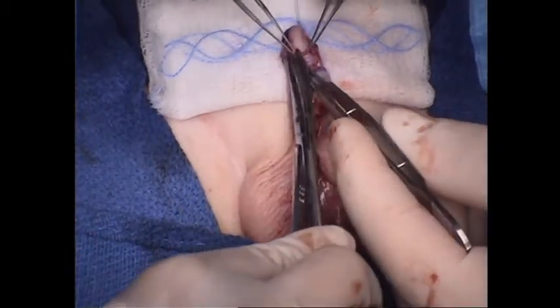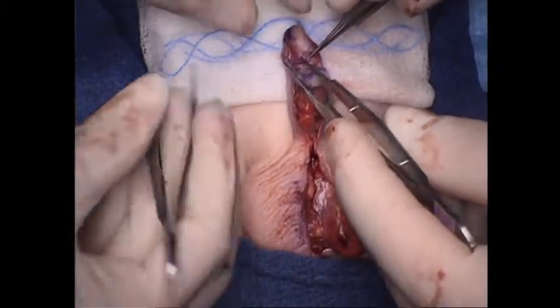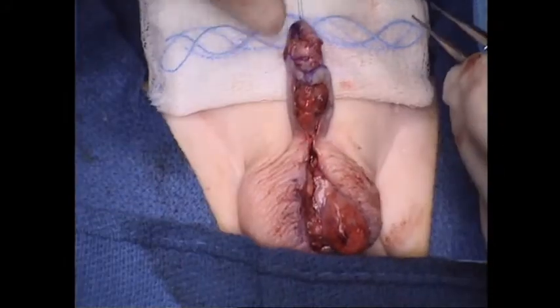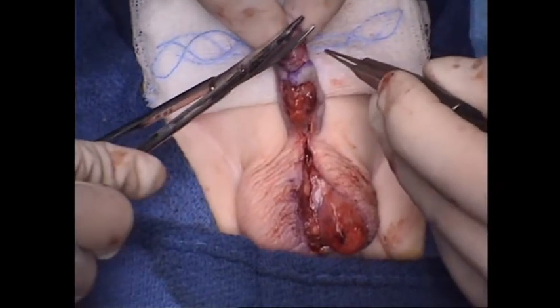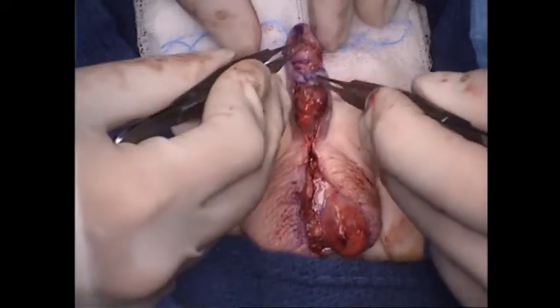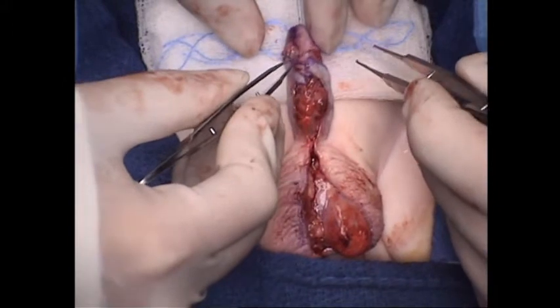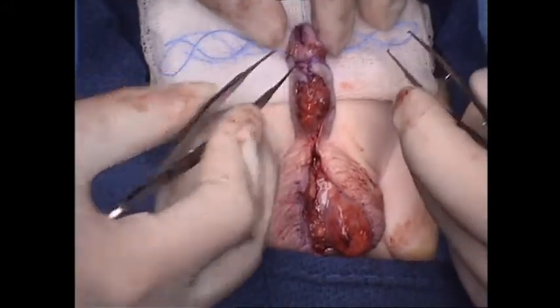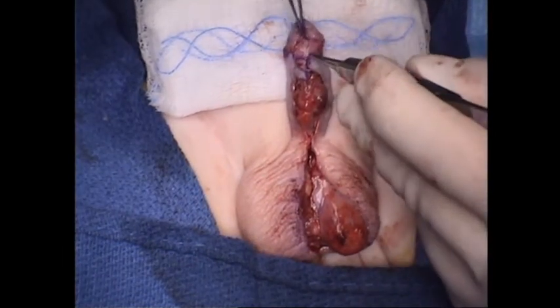right here. And that will give a pretty natural appearance to things. We can tailor that up at the next step if we need to, to try to make that a nice, smooth mucosal collar all the way around. And then we'll go ahead and utilize this area for our shaft coverage, our anastomosis to the shaft skin for the mucosal collar.